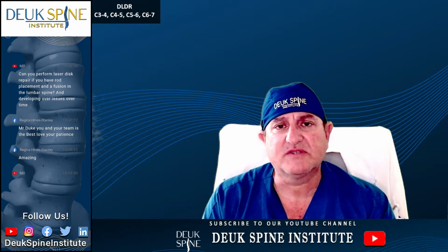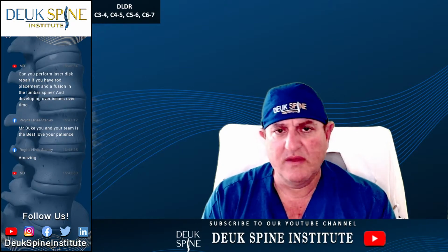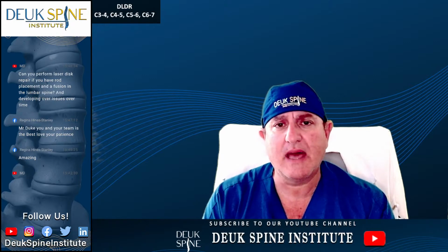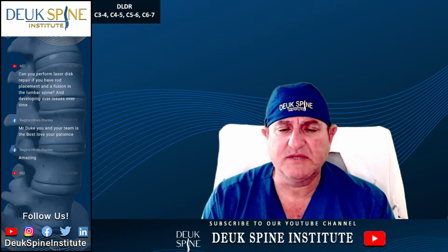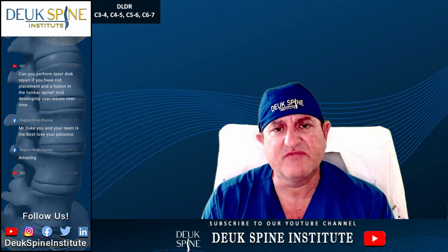So I was able to fix all 4 discs. Now, does that mean these discs are going to look normal on MRI? No. The discs that I worked on today are always going to be collapsed, degenerated. My goal was to make them symptom-free. And what symptom-free means is to take away the symptoms the patient has from the discs.